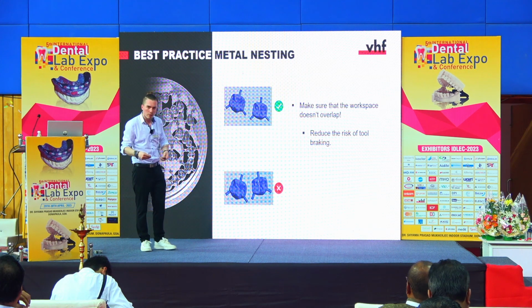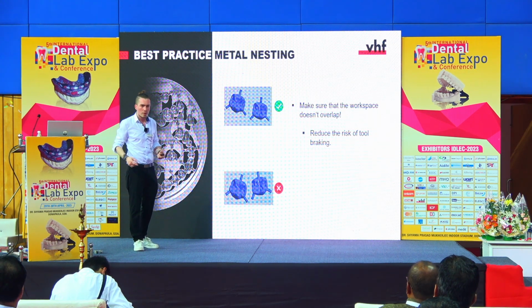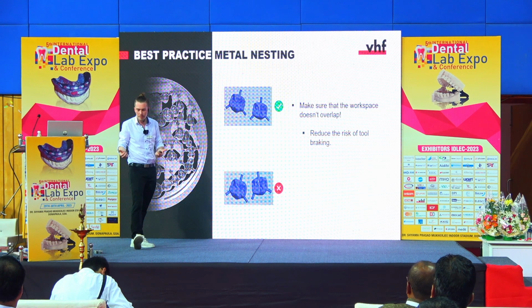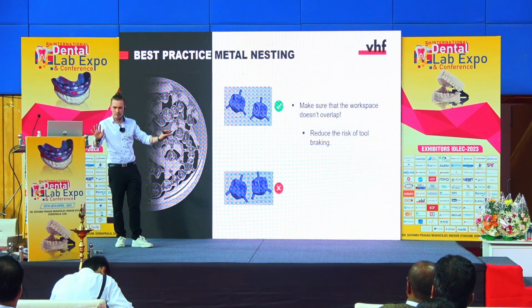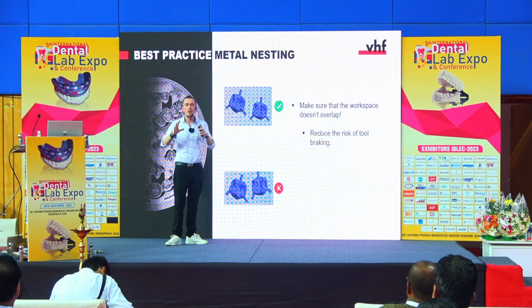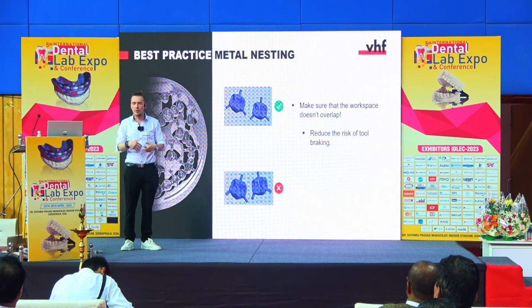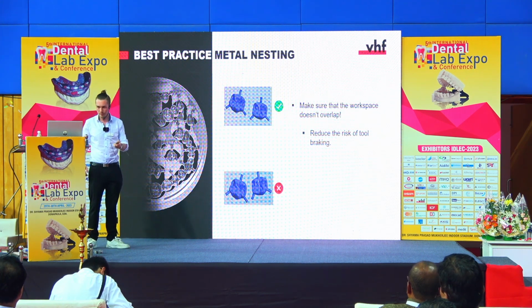And this will slowly lead to structural errors in the tool or in the collet chuck, and you face the risk of a tool break or having to replace the collet chuck. So for zirconia you can do this, or for soft materials, without any issues, but when you're milling metals or titanium, then just make sure that each object has its own workspace, because in the end you're saving more money without risking tool breakage than you're saving material.